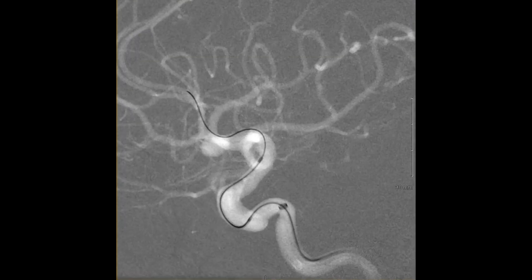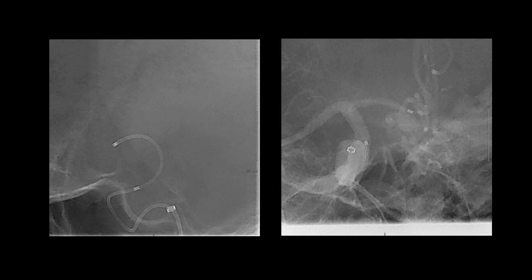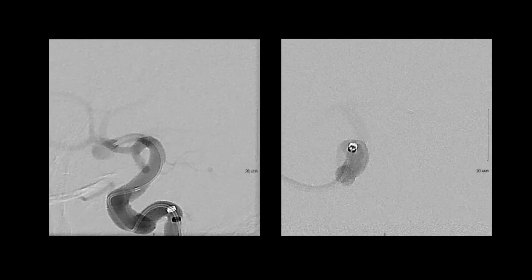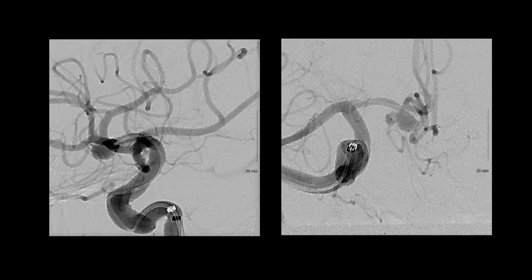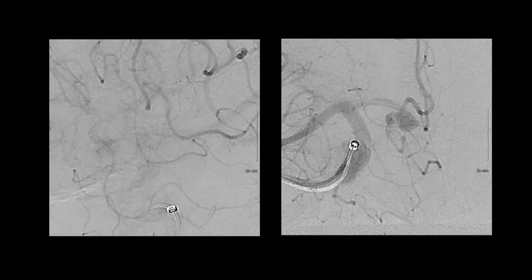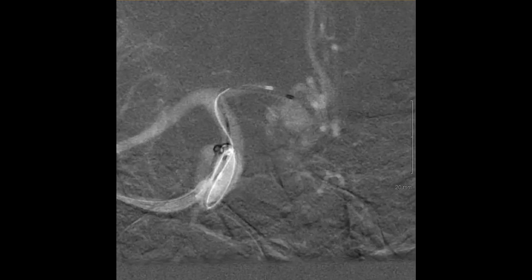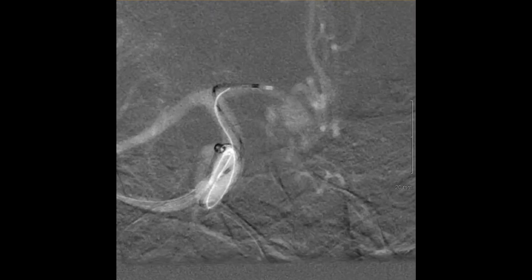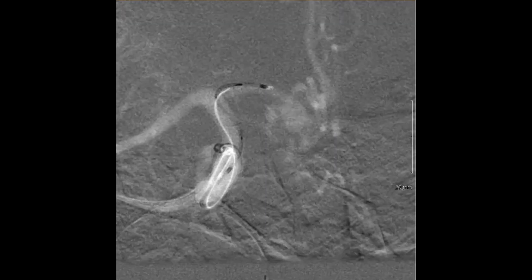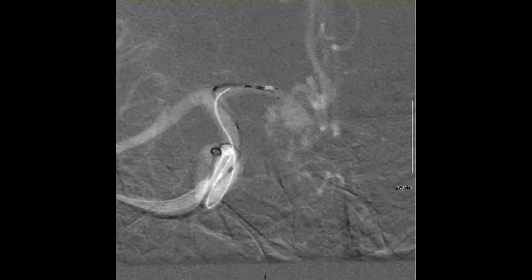Following this, the microcatheter was tracked to the A1-A2 junction. The Pulse Rider device was then delivered via the microcatheter, but this can be challenging in the distal circulation, as the microcatheter is seen backing up here without sufficient distal support.